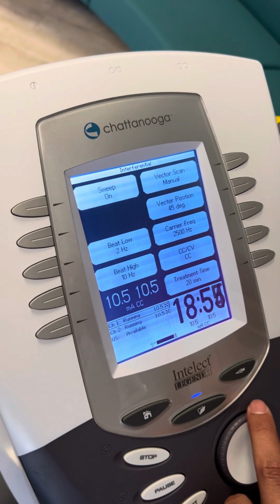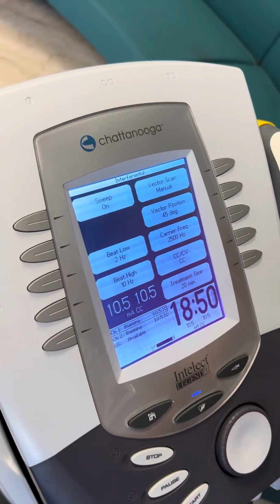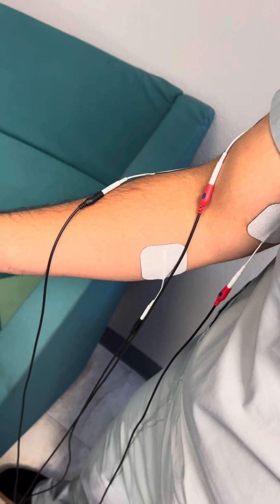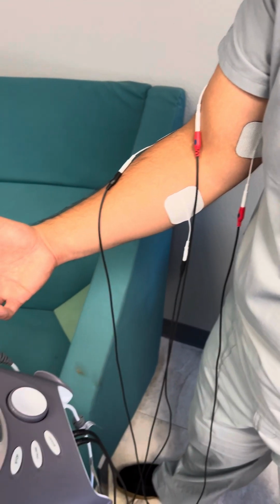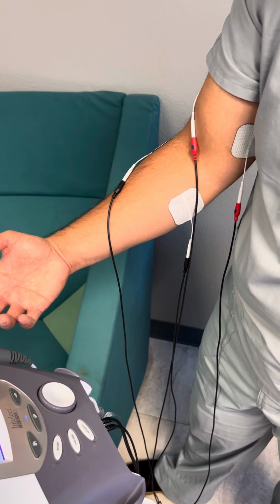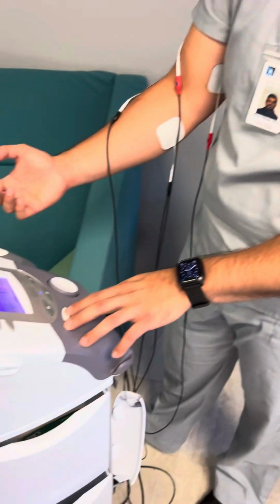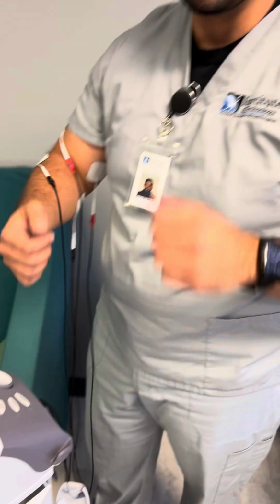And then the amplitude is also dependent on the patient as well. They're just gonna want to feel that twitch and that almost staticky sensation in the area. Just like that. Awesome. All right. So with that being said, I'm gonna go ahead and stop the treatment. Just like so. And then turn this off. Now we're good to go.